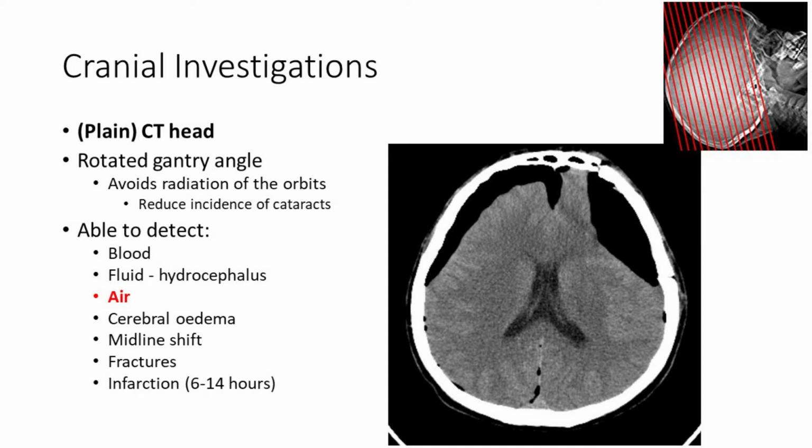That can occasionally happen with confused patients who pull at the drain and occasionally will snap them, and in this case you've got significant compression of the brain, and that could be an emergency on the ward where they need to put a cannula into the burr holes and again suck some of that air out, and air can give patients seizures, so they're at high risk of having that.